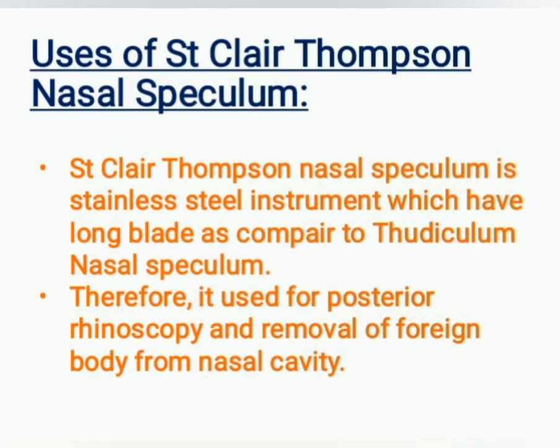There are uses of St. Clair Thompson nasal speculum. It is a stainless steel instrument which has a long blade as compared to Thudicum nasal speculum. Therefore, it is used for posterior rhinoscopy and removal of foreign body from the nasal cavity.